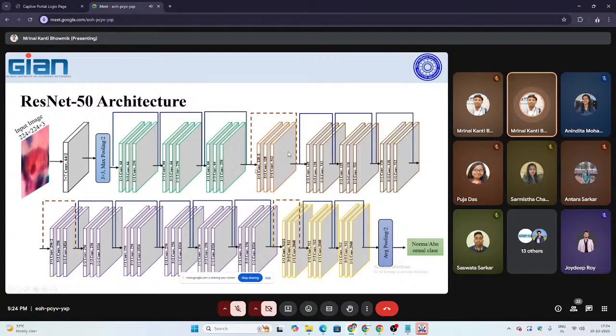One more thing: during the convolution block you can see the first layer is 1 by 1 convolution with 128 as the filter size, and we are taking stride 2 to match the other input size, so that it reduces its output value for the next input. For this purpose, in every convolution block, the first layer has stride 2.